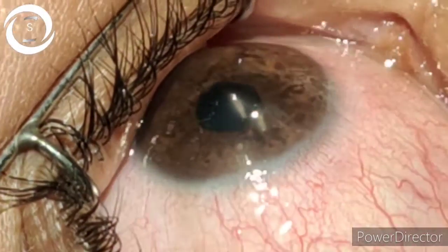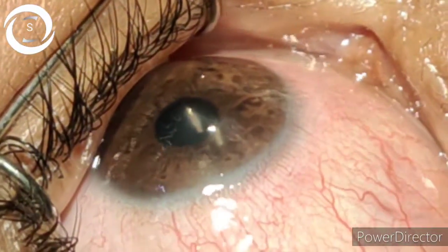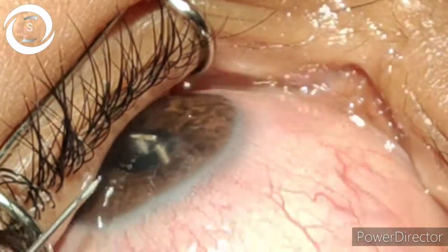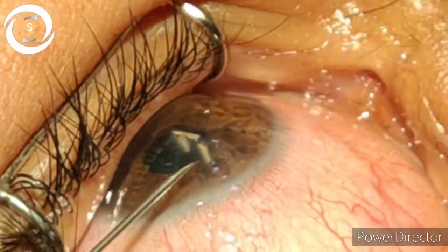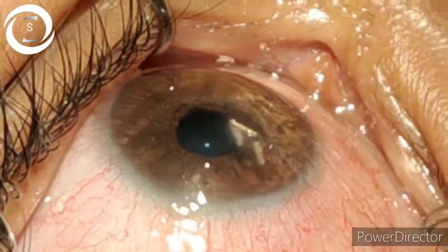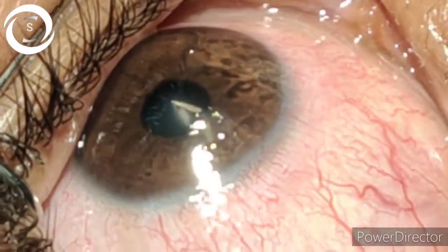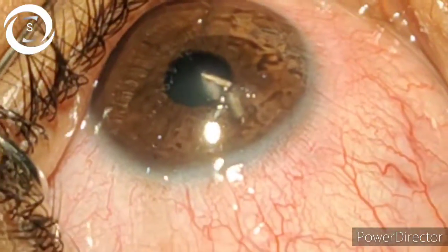You can clearly see under the operating microscope that the two tips are exposed. Now with the one cc needle I just try to remove it, and you can see that the foreign body near the pupil has almost come out of the stroma.